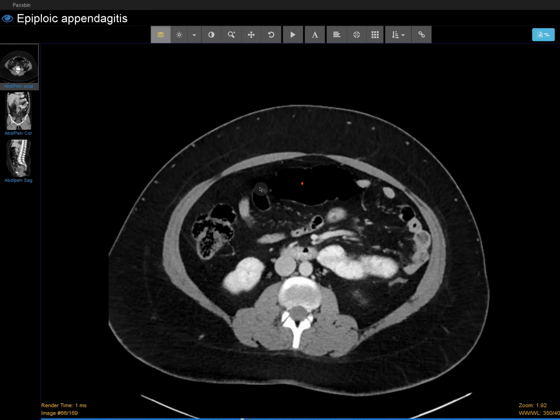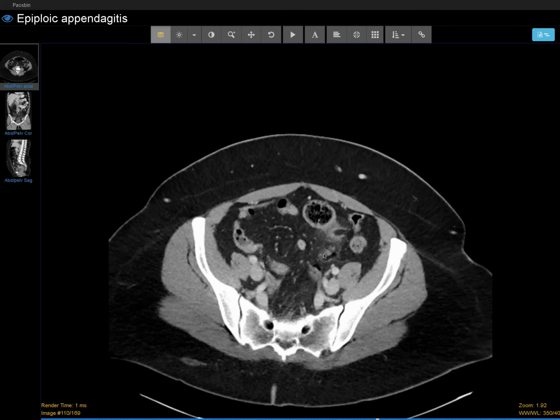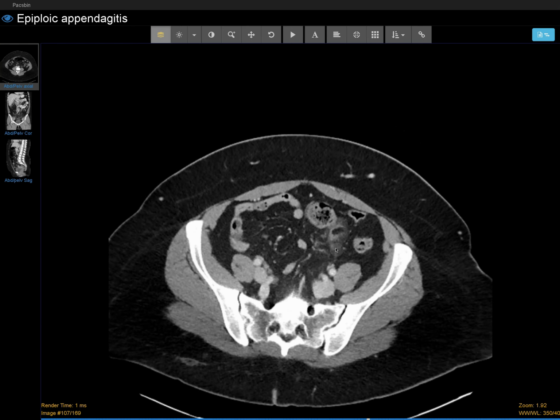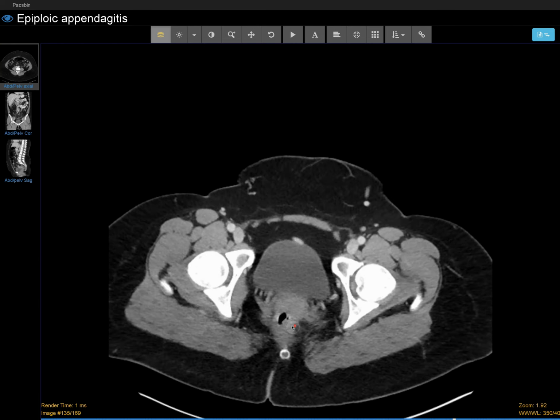Quick look at the bowel loops. They're overall normal in caliber. I go down, look in this general area, and I do see fat stranding in this area. Now, my top thought is, could this be a diverticulitis? So let's follow our colon from the bottom.